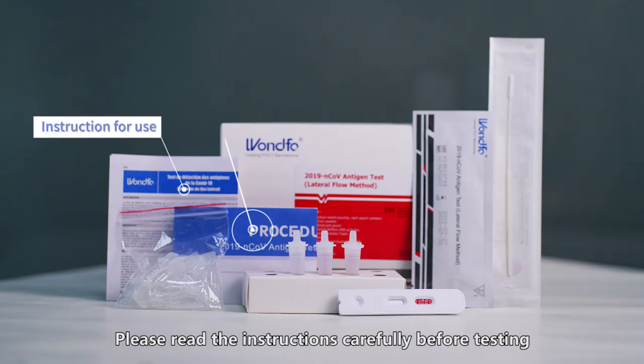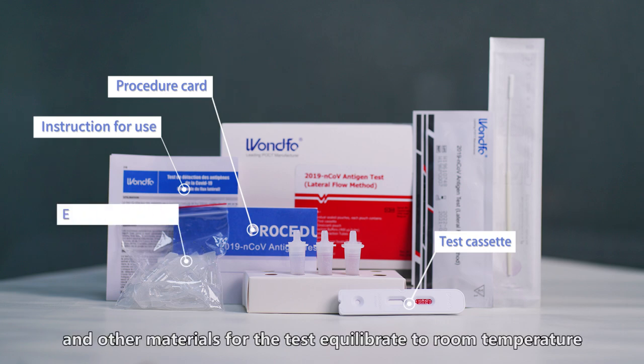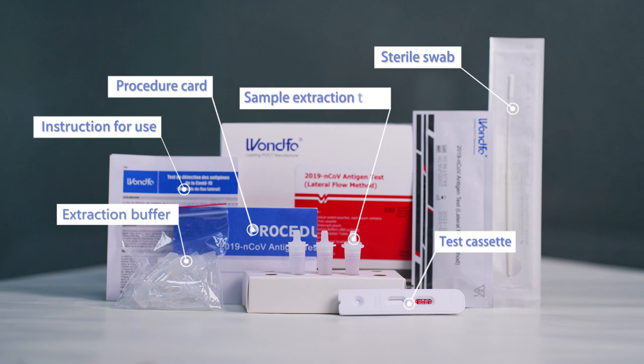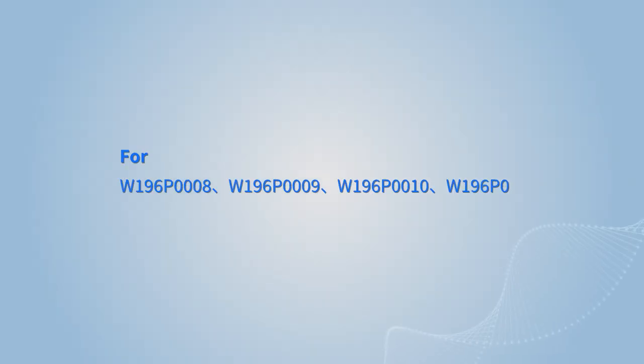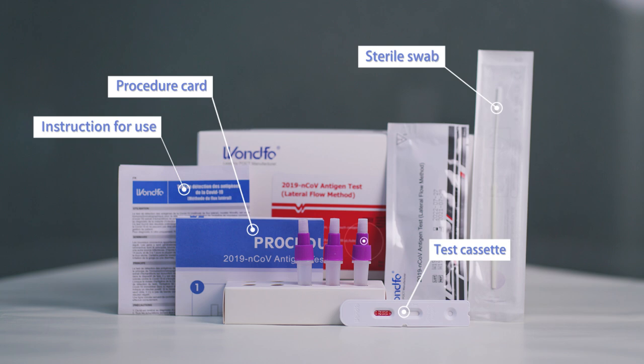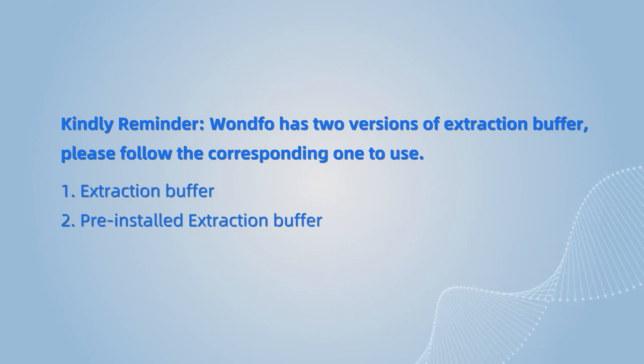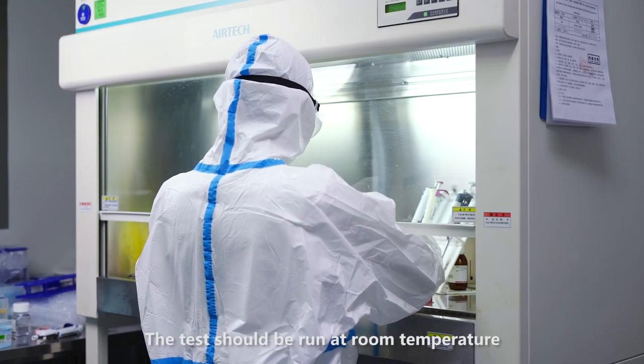Please read the instructions carefully before testing. Let the samples, reagent, and other materials for the test equilibrate to room temperature. The test should be run at room temperature.